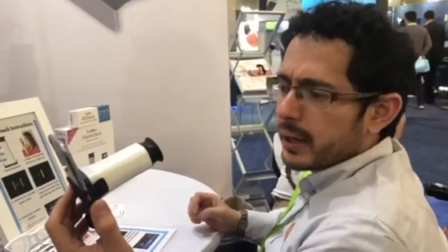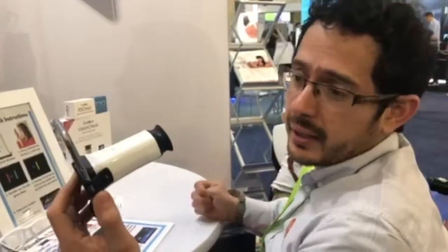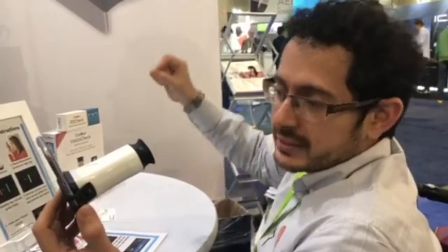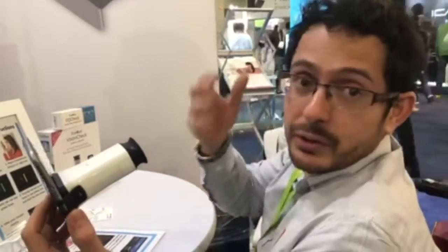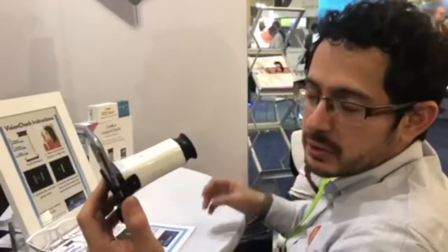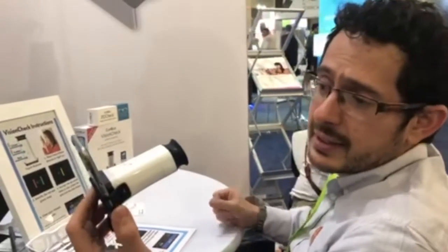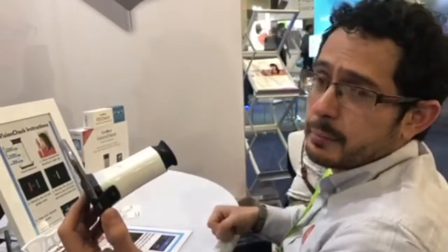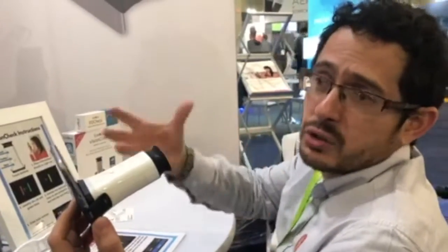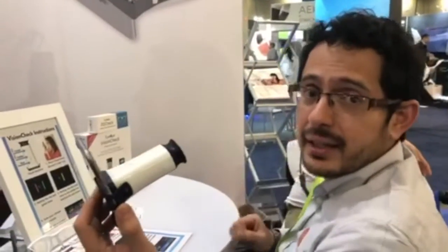It's quite easy to use. I really like it. The result was good. I don't quite remember my exact prescription, but yeah, it's around that number. For the price, I believe it can help in places where there's nowhere nearby to check your eyes and buy glasses.